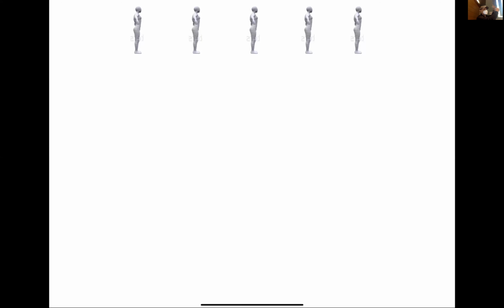Third, did you say something? Which way would be clockwise? Right, you would turn to the right. And so if you were one of these spins and you were in this room doing this experiment in a uniform field, what should the coordination of these spins be? They should all be going at the same rate, right? They're all experiencing the same field.